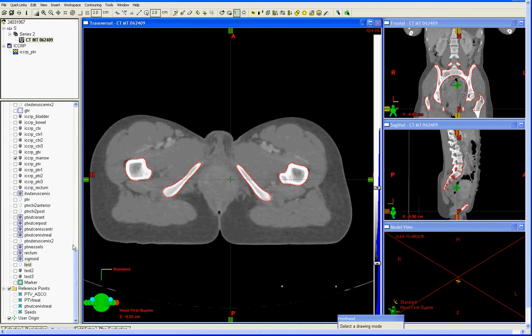There are some automated tools in Eclipse, and there may be analogous tools in other treatment planning systems that can speed the bone marrow contouring. One is flood fill, the other is CT Ranger. I'll go over those techniques.